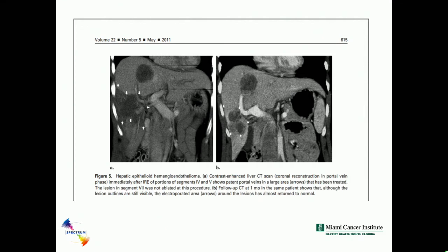So we're going to talk a little bit more in detail about this technology, but one of the key factors is this is not a thermal ablative technique. The traditional ones that we used before IRE, such as microwave ablation, radiofrequency ablation, or cryo, are classified under the category of thermal ablation. And in 2009-10, IRE was introduced first as a non-thermal ablative technique.